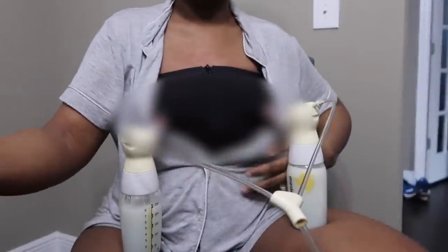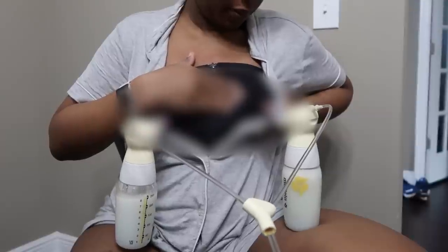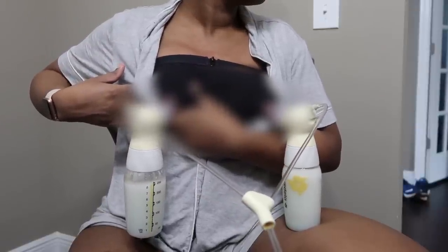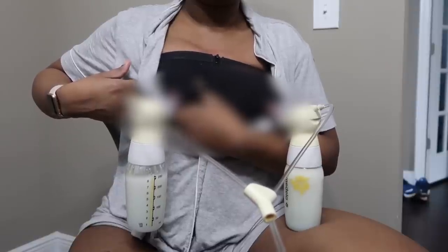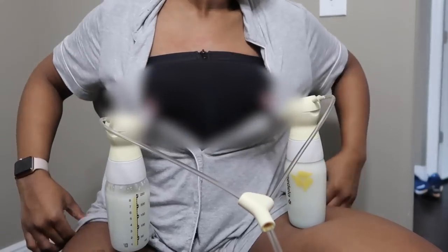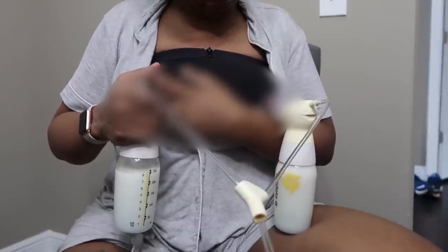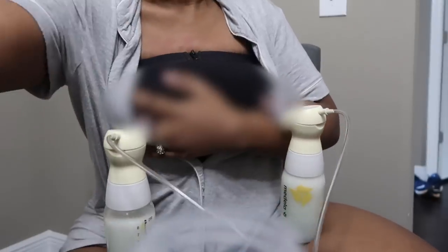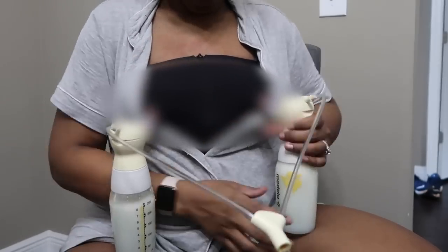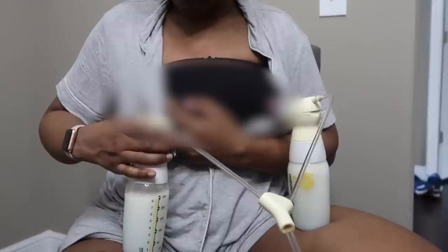Elastic nipples is basically when your nipples double in size when you pump or feed. This can hinder me from producing enough milk and sometimes ends up killing my milk supply because I have a lot of issues with clogged ducts. There are companies that provide special flanges for elastic nipples, but I didn't find them useful — they actually hindered me even more. So I stick with my regular flanges and I use my hands to lock around the nipple area and push on those ducts to help release the milk. You're going to see me do this a lot throughout the video.